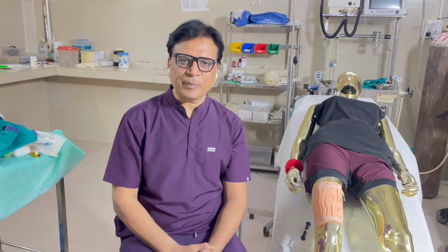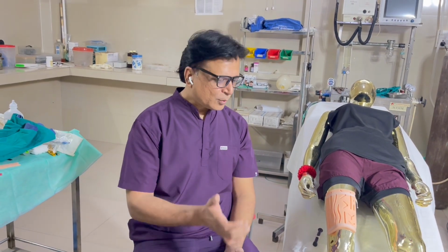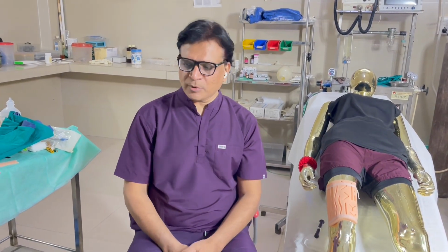The third, it can be to take a subcuticular stitch, or there can be a demonstration of one hand tie, or there can be a demonstration of suturing the material, suturing inside the depth. So these are the different stems which you need to demonstrate.